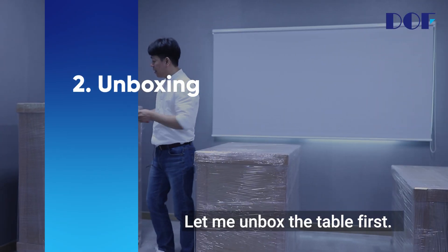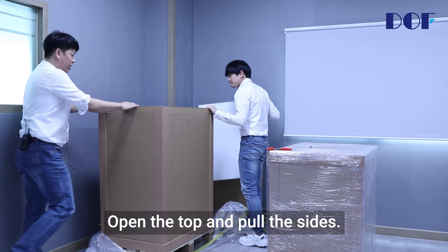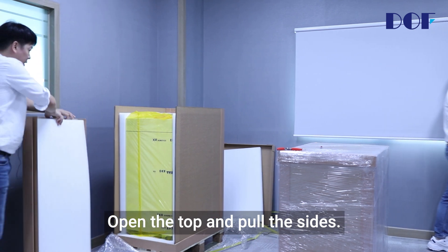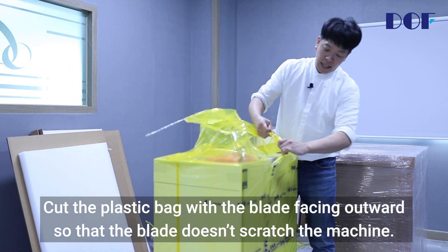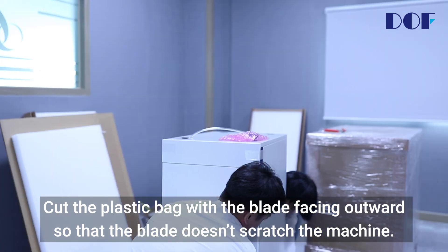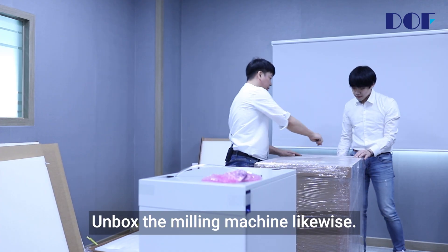Unboxing. Let me unbox the table first. Cut the plastic wraps, open the top and pull the sides. Bring the table on the floor. Cut the plastic bag with the blade facing outward so that the blade doesn't scratch the machine. Unbox the milling machine likewise.